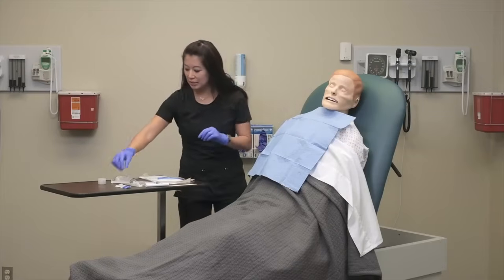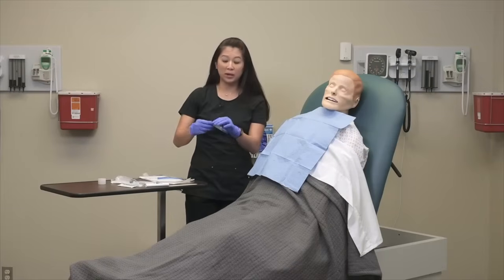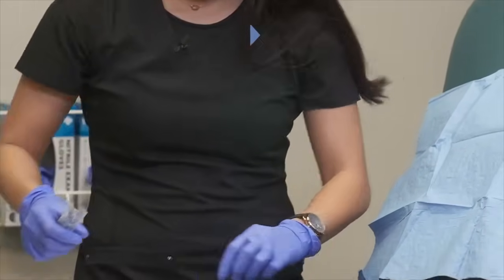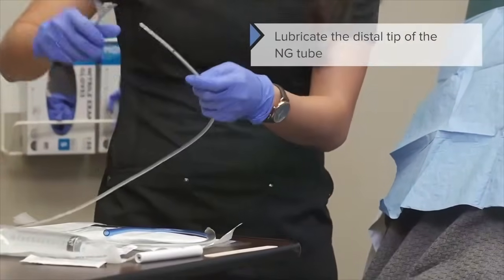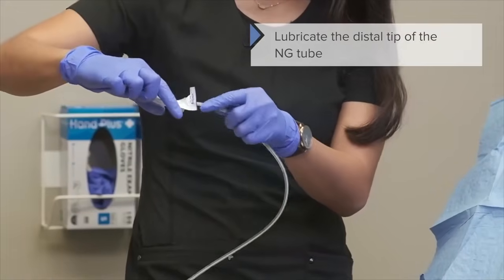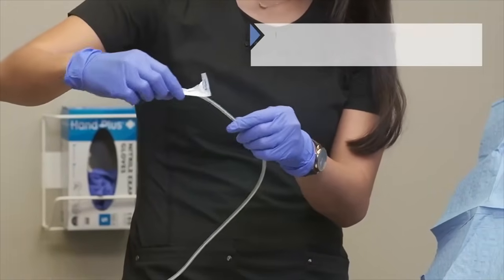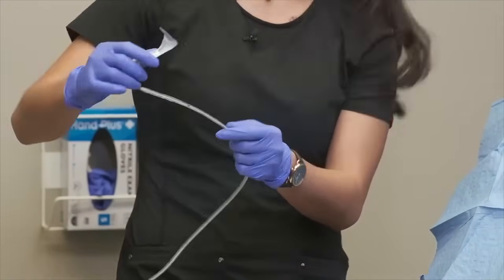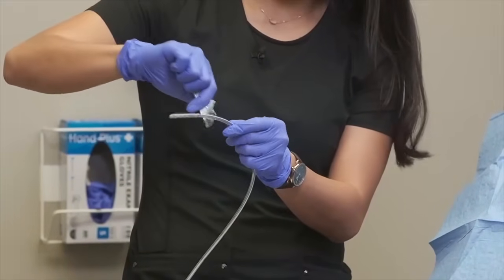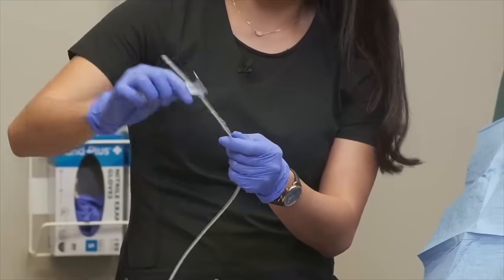Okay, so now that's set. Now I'm going to prepare my equipment, and I'm going to lubricate the tip of my nasogastric tube. You may see a nurse stick the tube down into the surgical lubricant, but I just want to be extra nice as a nurse and make sure this is really well lubricated.